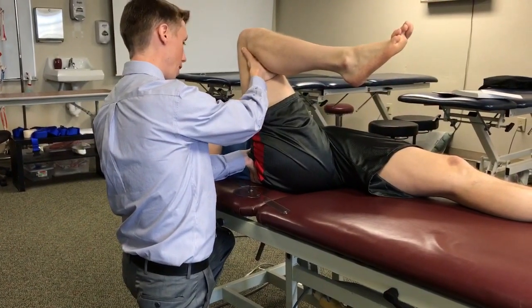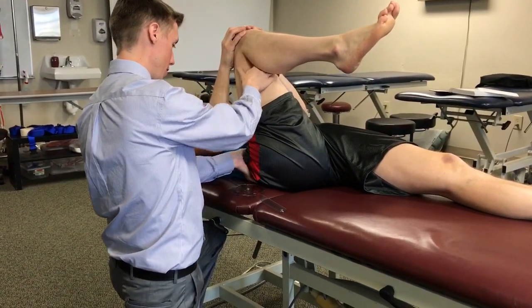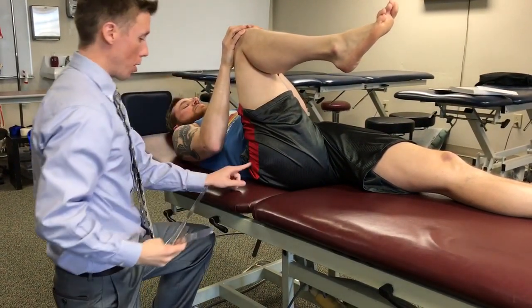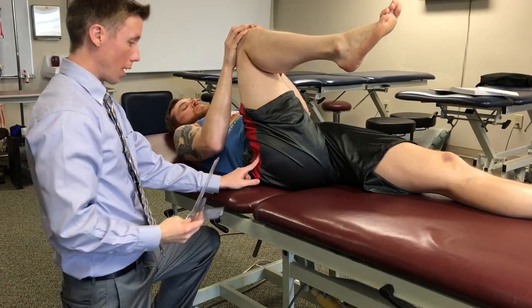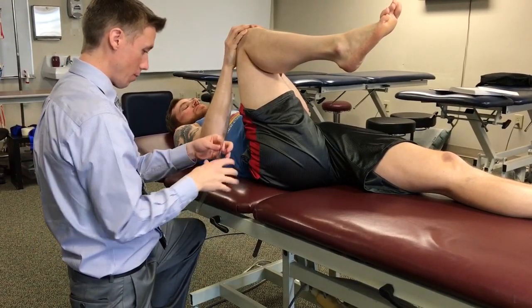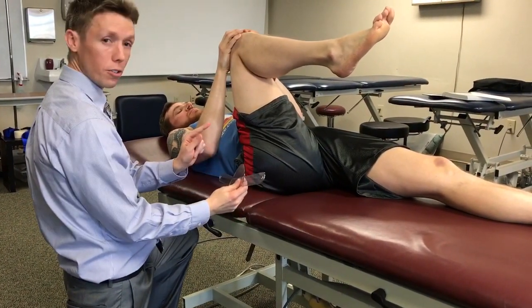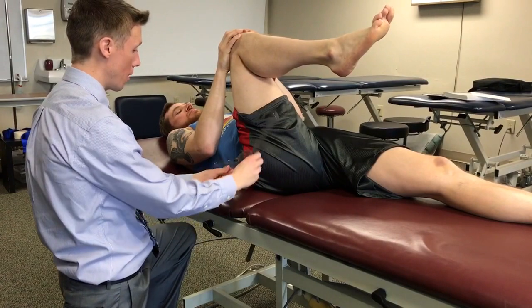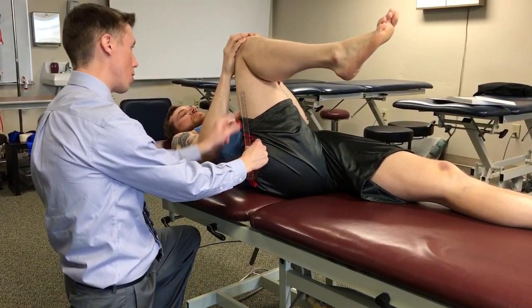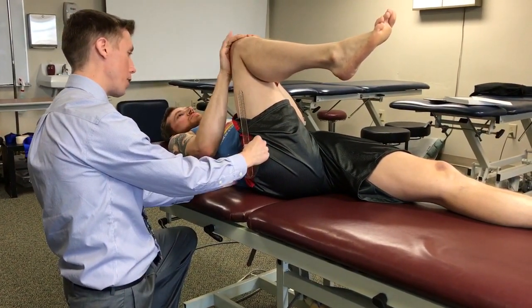Once I feel that I ask him to hold it there. I use the landmarks of the greater trochanter for the fulcrum. The stationary arm is parallel to the midline of his body and the movable arm is in line with the lateral epicondyle of the femur.